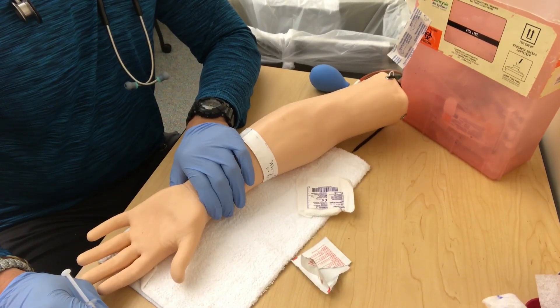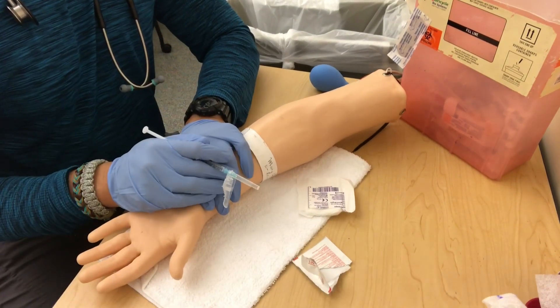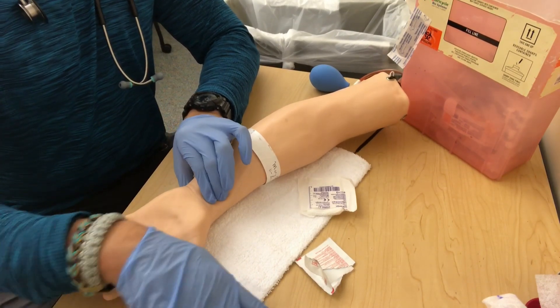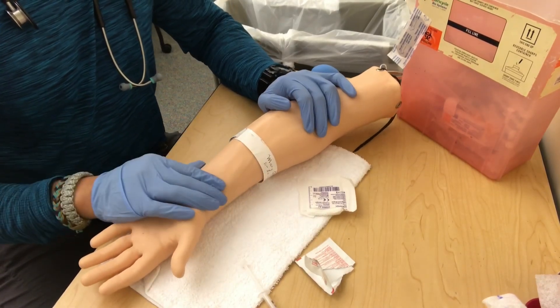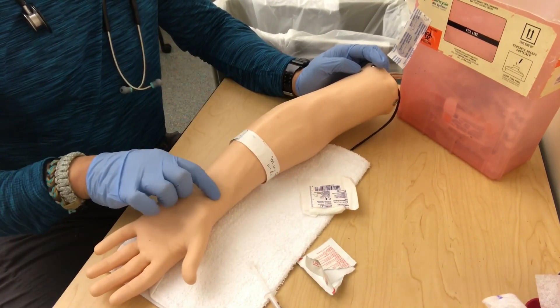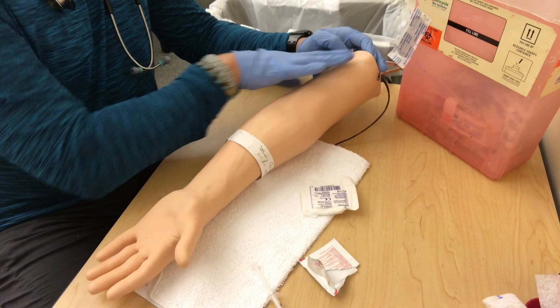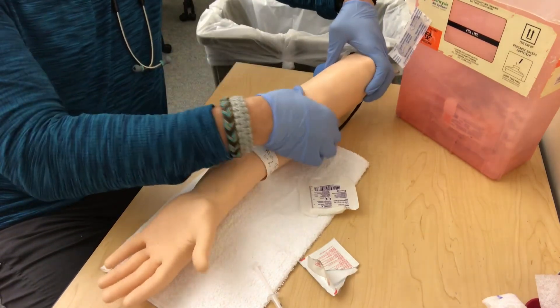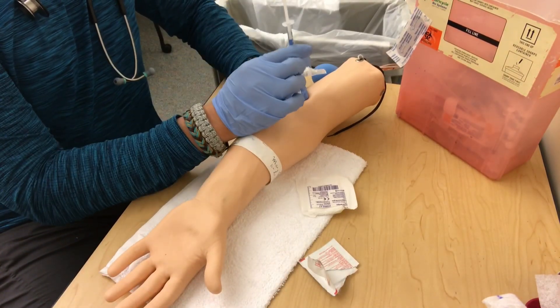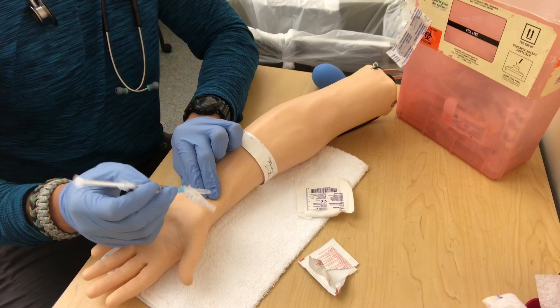If the patient is talking, ask if they're right- or left-handed. The dominant hand usually has a stronger pulse. Check both and go for the stronger pulse. We're going to do a radial pulse, but note there are other locations — we could go brachial if circulation isn't good here. The brachial is between the elbow and bicep on the inner side. For the radial approach, the angle is 45 degrees and we hold it like a pencil — a bit different from venipuncture.